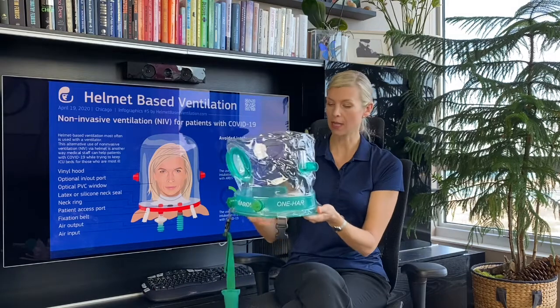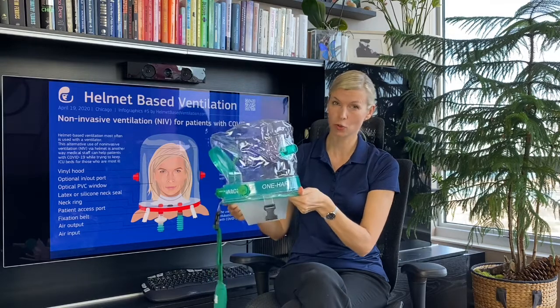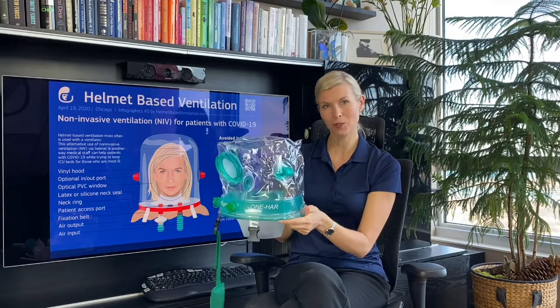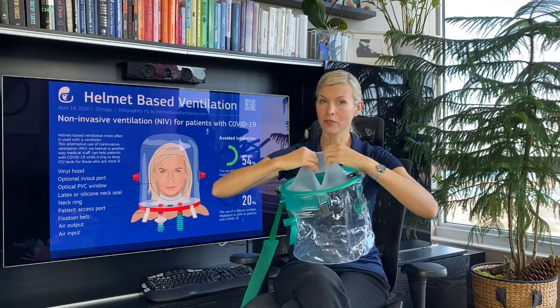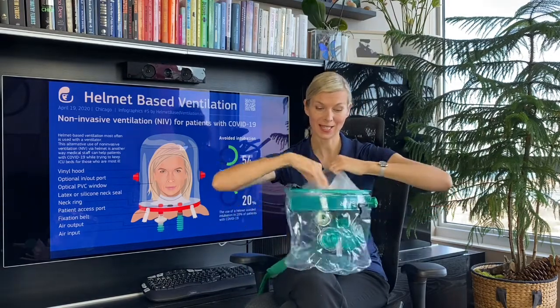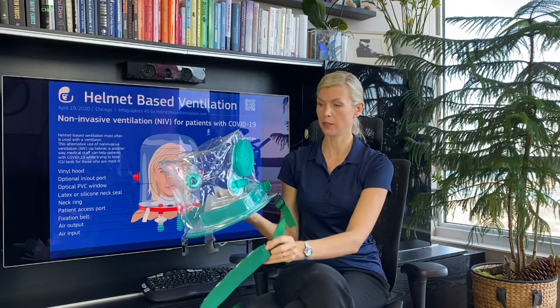This one-piece helmet has a hard ring on the bottom. The hard ring is very light and thin, so it doesn't add any weight to the helmet. It connects the top part with the bottom soft collar. It is silicone, stretchy, and as you can see it doesn't rip when you stretch. It's pretty thin so it should feel really comfortable on a patient's neck and cause less skin irritation.